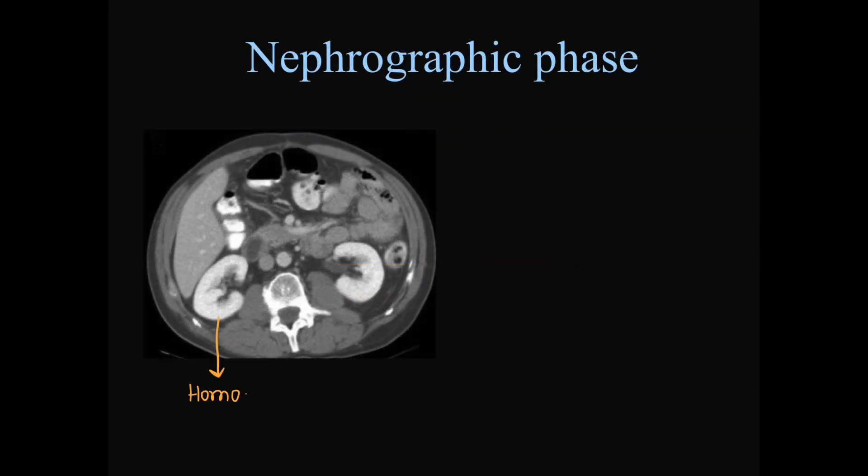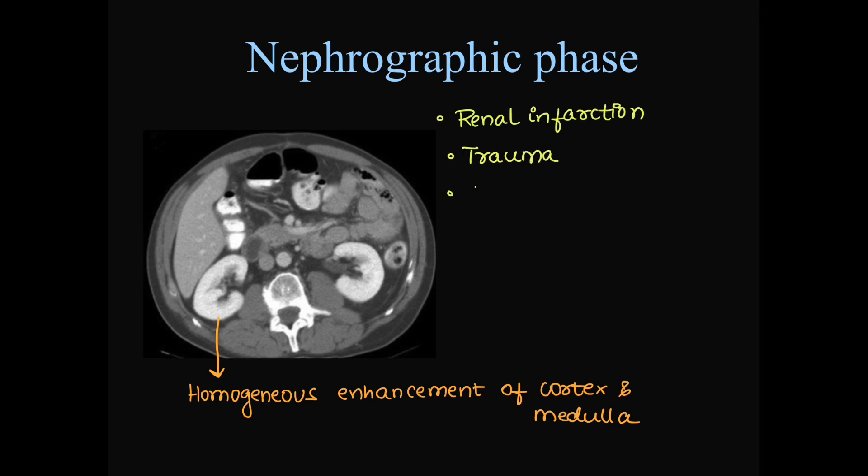Next, in nephrographic phase, this is how we can see this homogenous enhancement or uniform enhancement of the whole renal parenchyma including cortex and medulla. If any renal lesions are present like renal infarction, renal trauma or acute pyelonephritis and especially renal masses can be very well seen in this phase. If they are less than 3 cm, they can be very well identified. And all these appear as hypodense areas against the background of enhancing renal parenchyma.